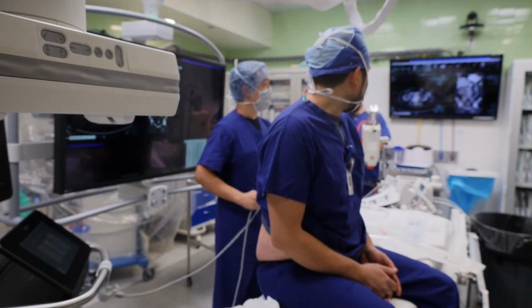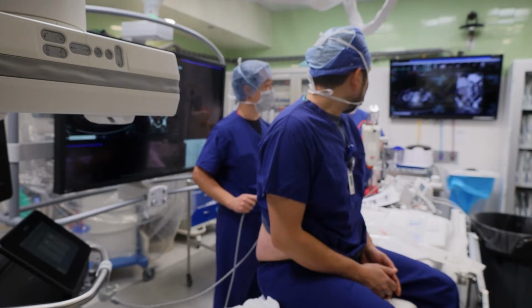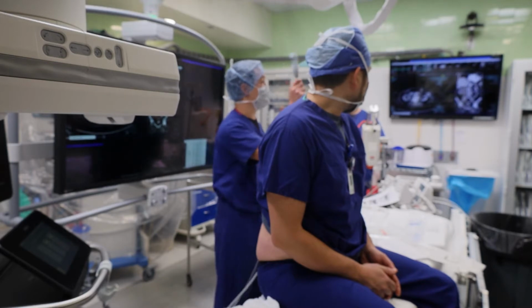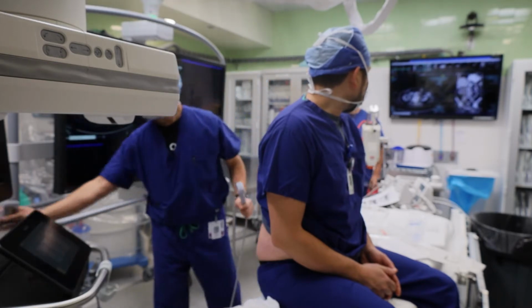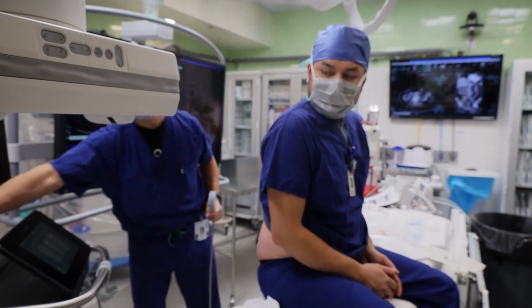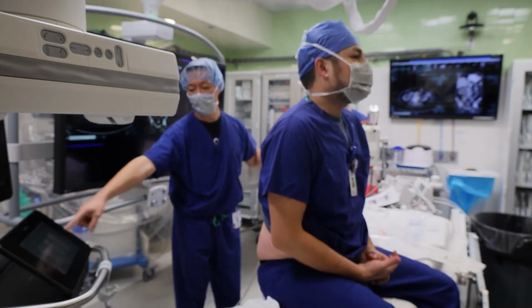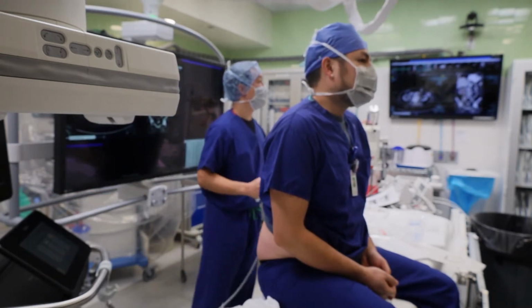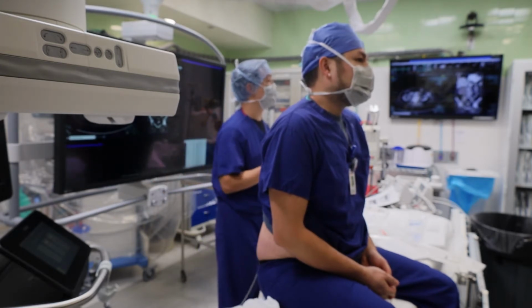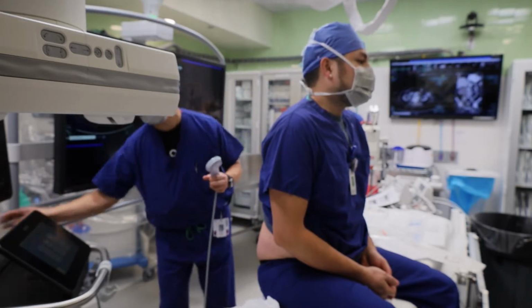Deep objects, like the liver, 10 centimeters in, 15 centimeters, and kidneys, since some of our patients are large, we always use this. We almost never use this for kidneys. There are many settings on this machine that determine how the picture looks. It has to do with the way that the image is processed and the frequency used. Out of all of these, we almost always only use the abdomen mode. If you want, feel free to try the other modes and see how different the kidneys would look.